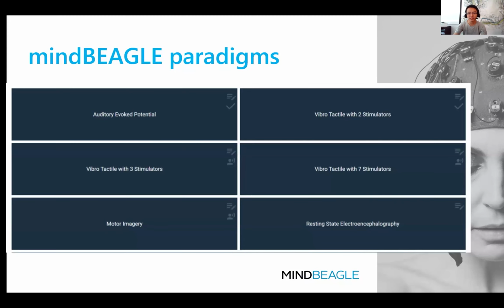As you may notice, there are some markers on each of the paradigms. I don't know if you can see it clearly. For example, there is a small notebook mark here.